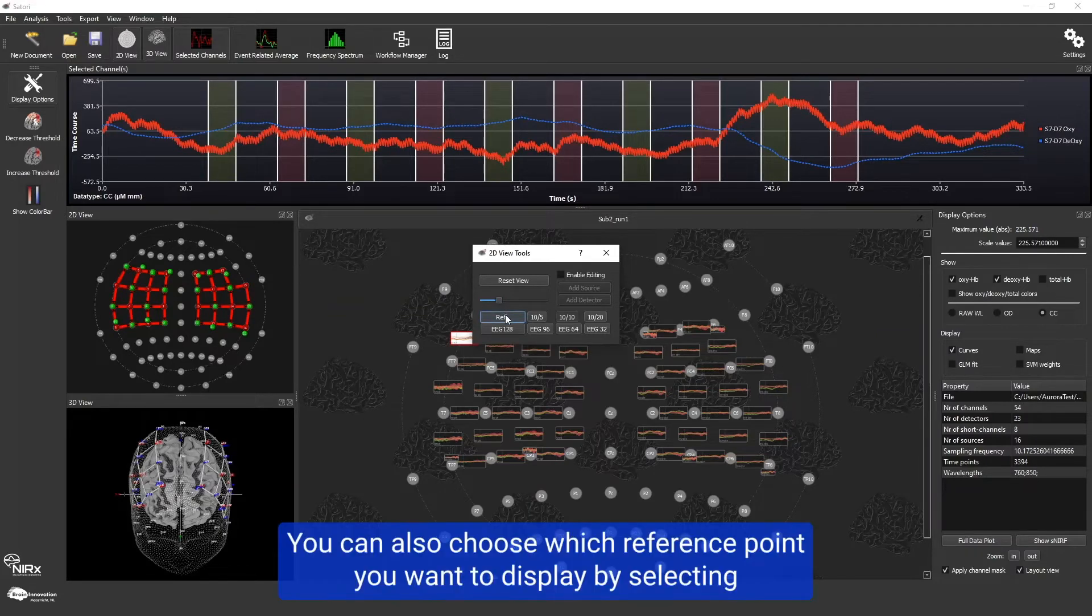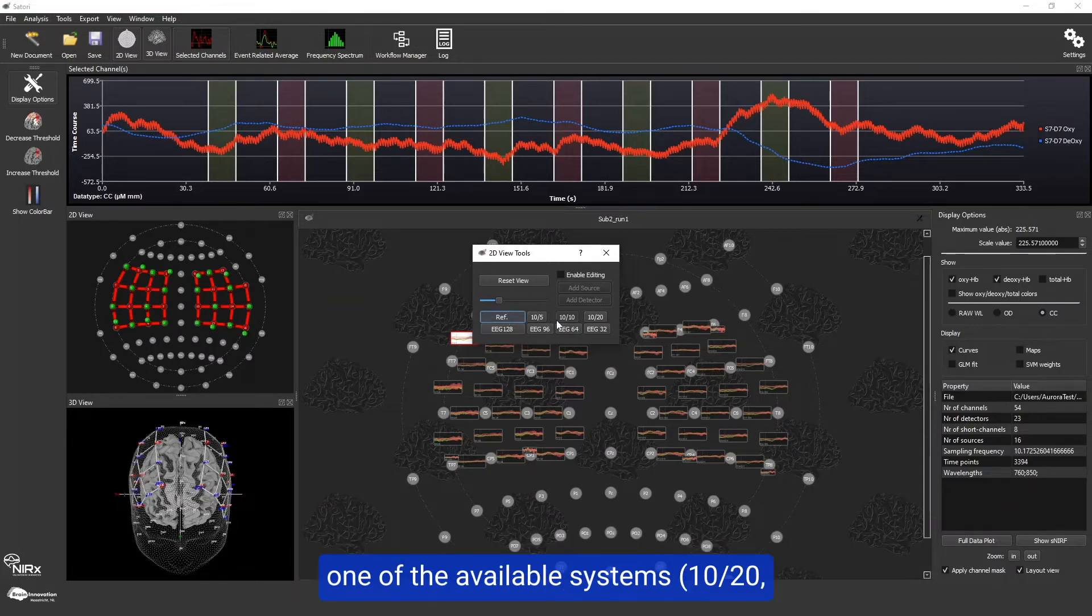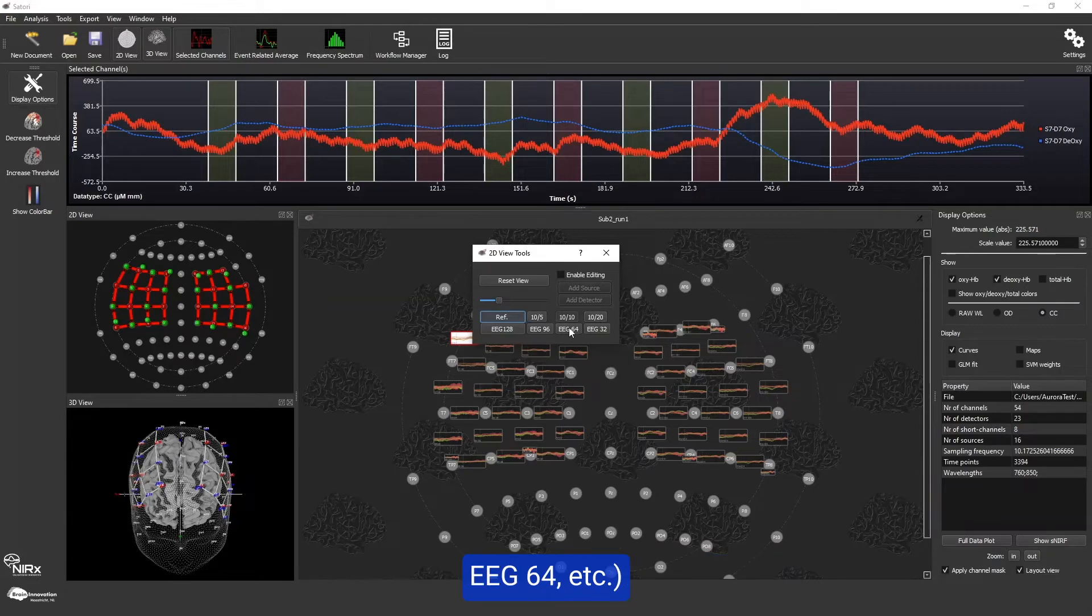You can also choose which reference point you want to display by selecting one of the available systems: 10-20, EEG64, etc.